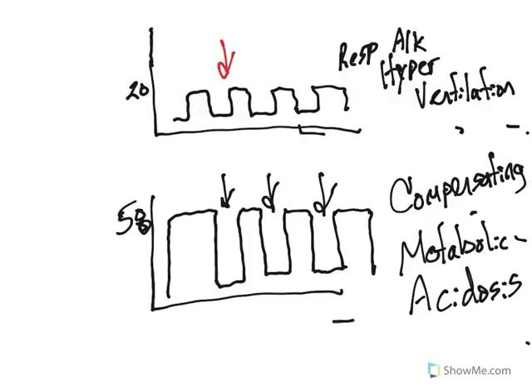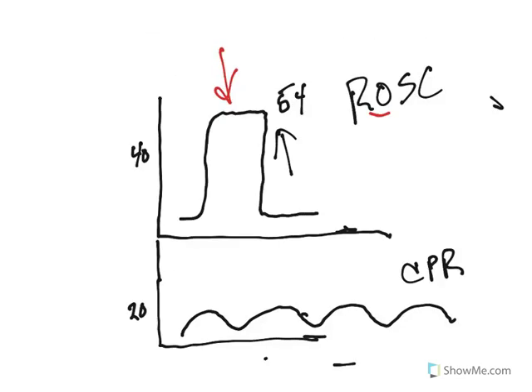If we go back a couple of slides, what we're looking at is a patient who is, in fact, dealing with respiratory acidosis, okay? And normally what we would see out of this patient is that these would extend, but they'd be kind of far apart.